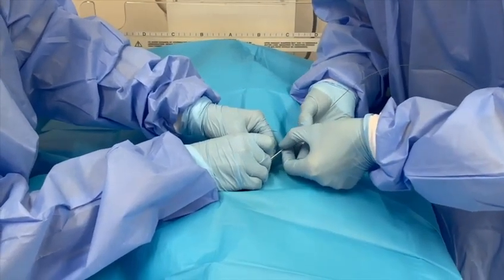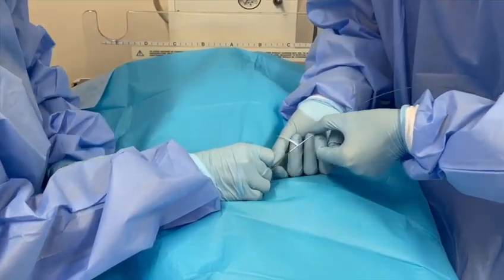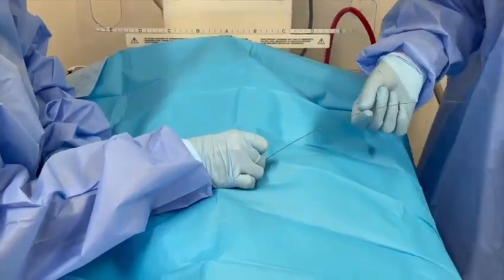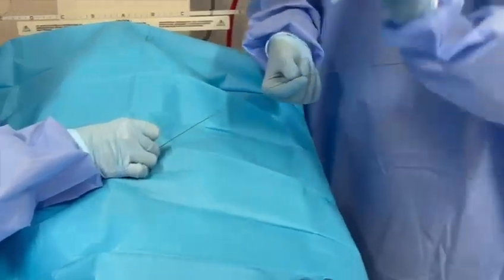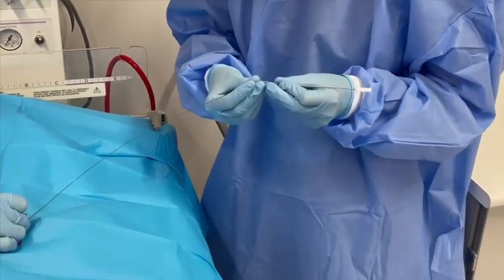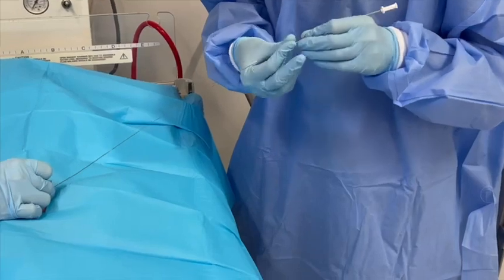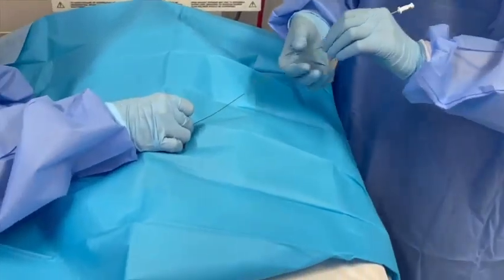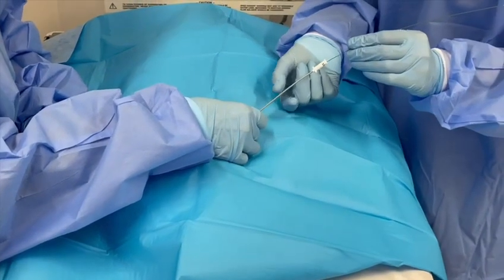Remove the needle, ensuring the guide wire is held in place at the skin. Thread the dilator over the guide wire and insert about 1 centimeter through the skin, then withdraw and remove the dilator. At all times the wire must be held still, not advanced or withdrawn.